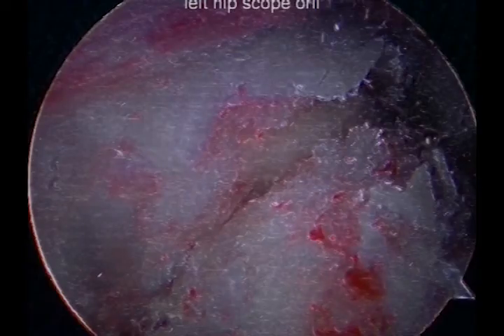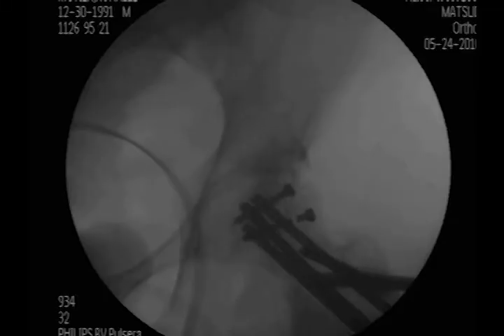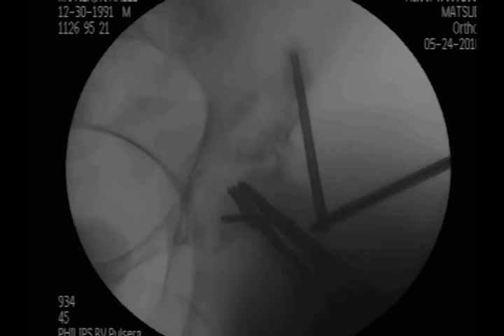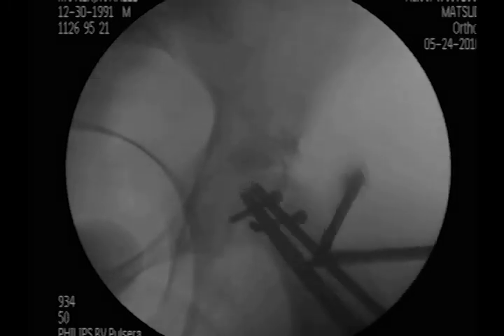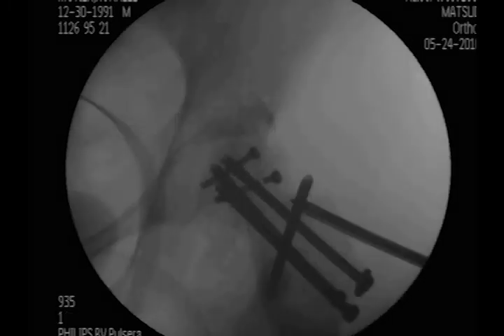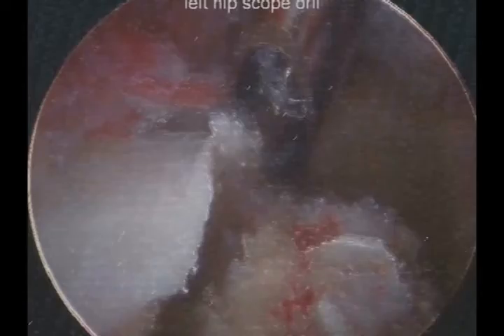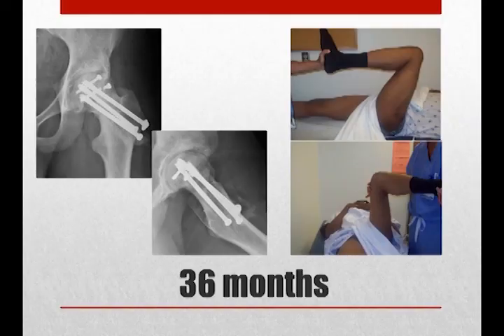We then fixated the fracture similar to percutaneous fixation of femoral neck fractures, from outside in with three lag screws. We then used an arthroscopic burr to resect a small osteophyte from the intact protruding lateral column and then checked range of motion to ensure impingement-free motion on arthroscopic and fluoroscopic exams.